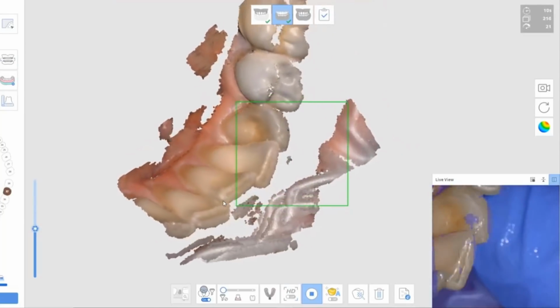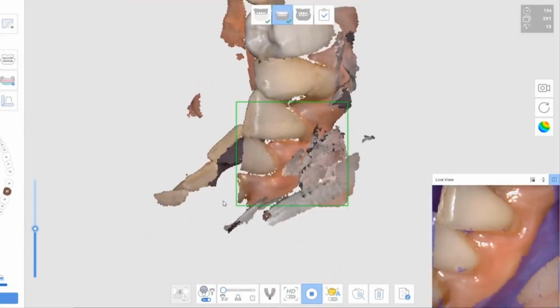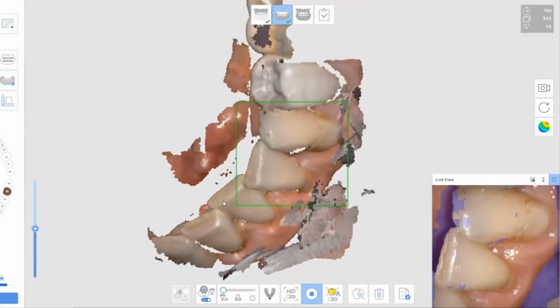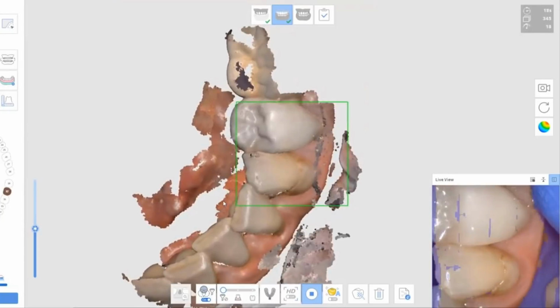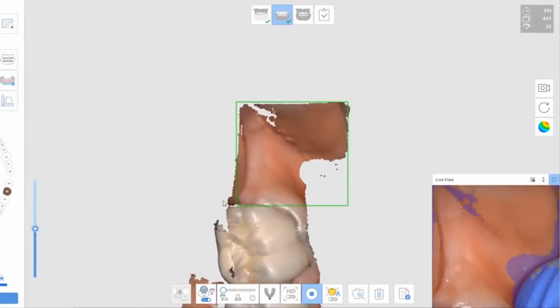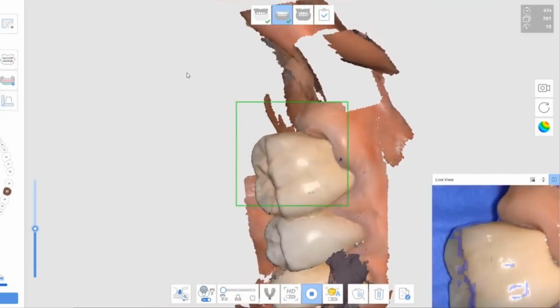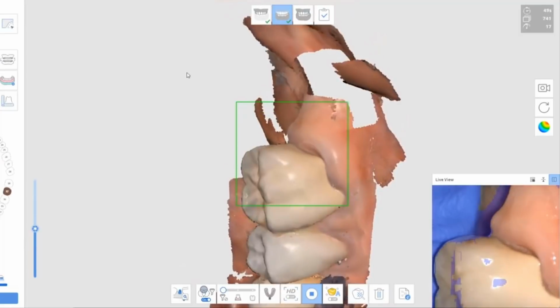So the combination of the short focal distance from the tip of the camera, but more importantly the blue color of my gloves, without any suction, without any assist, without any air blowing on top of the teeth, although the camera itself does project air onto the surface. It keeps the mirror from fogging. I can fill in and pick up all this data.